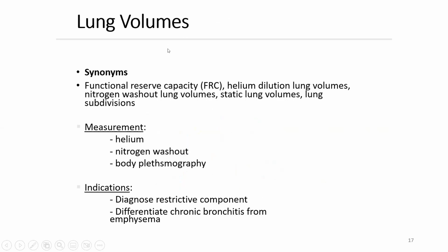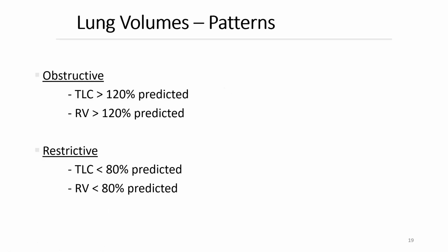How to measure the lung volumes? This can be assessed using gases like helium, nitrogen wash-out lung volumes, or plethysmography. This is to diagnose the restrictive pattern. This is an advanced test.